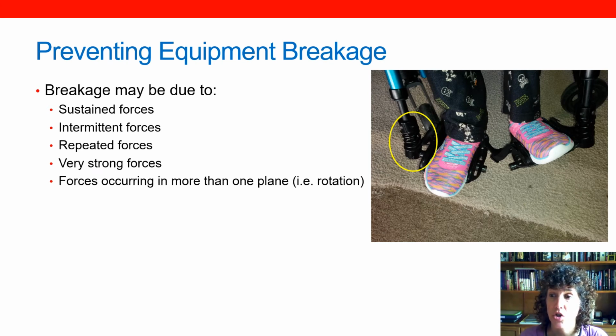Here in this picture, there is a spring which is actually designed to prevent breakage. It's designed to absorb forces, but this client has exerted so much force against it that it has actually become bent.